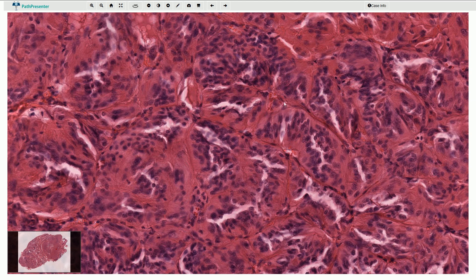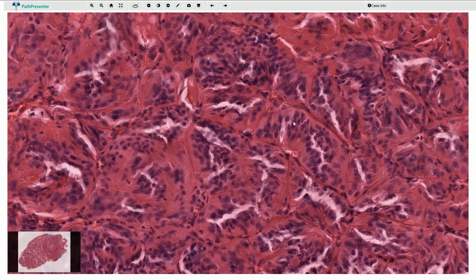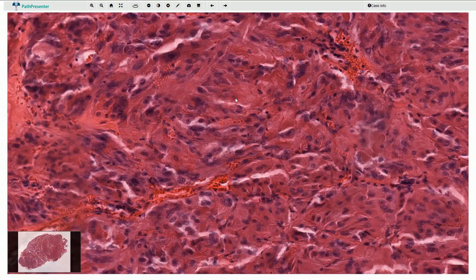In this area we can see again the typical thin fibrovascular septa outlining these trabecular nests. If we run immunohistochemistry for Ki-67, we would see quite specific unusual membranous positivity in all of these cells. In between these cells we can sometimes find foci of hyalinization, as seen here for example.